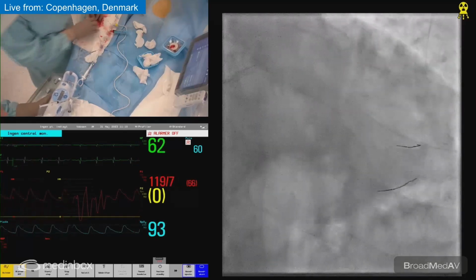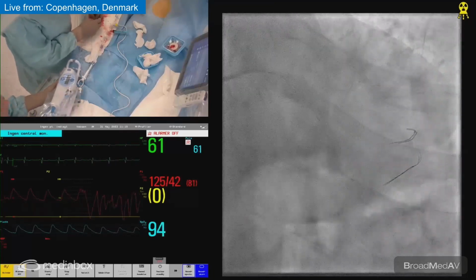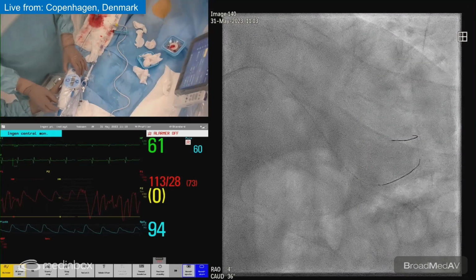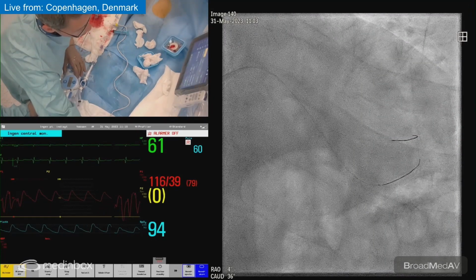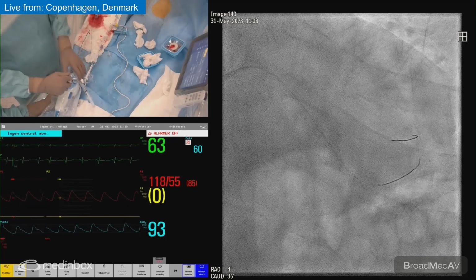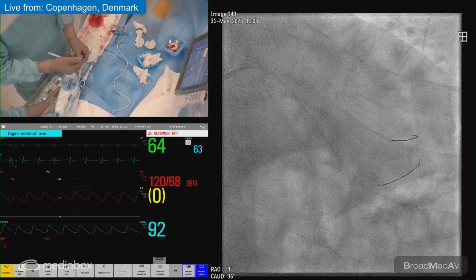We don't have one, but we have the stent balloon we can reuse. So that's what we're gonna find out now, and then we're also gonna find out with the IVUS how long the proximal stent should be, and find the landing zone.